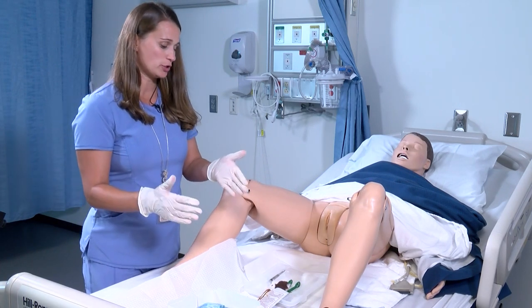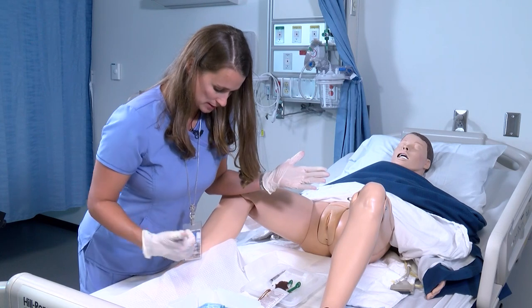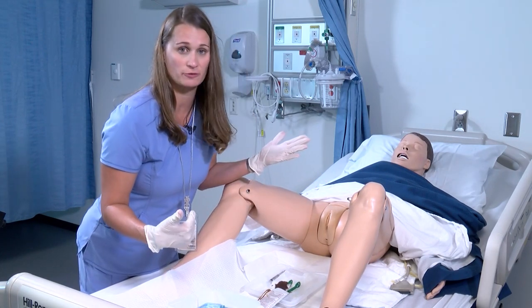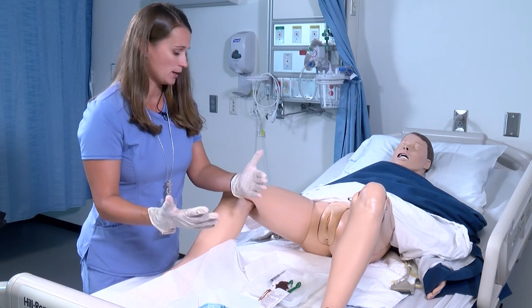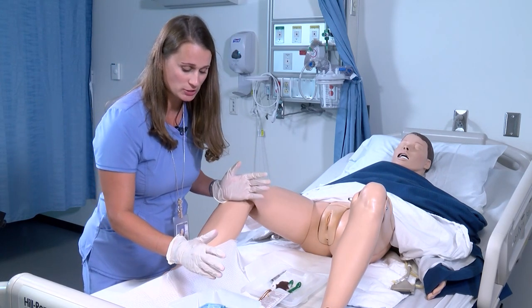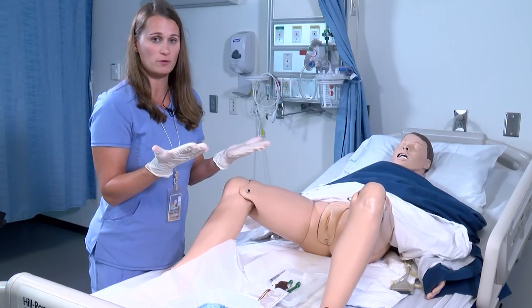The next thing I want to show you is you want to be aware that as you're leaning over, you're not letting your badge, stethoscope, or hair into your sterile field — that would be a point of contamination. Also, you can be unaware of what one hand is doing or that it's touching the patient, so you always want to keep your hands right in front of you and above waist level at all times.